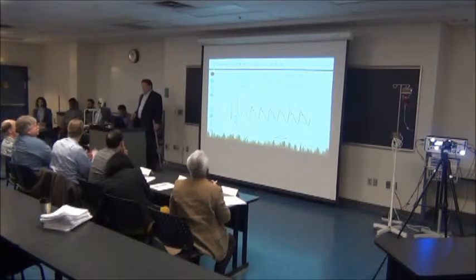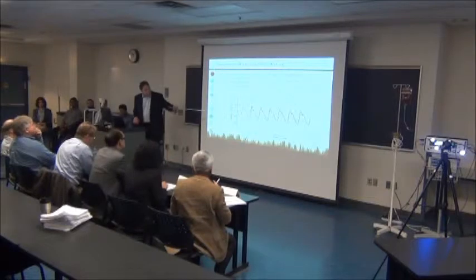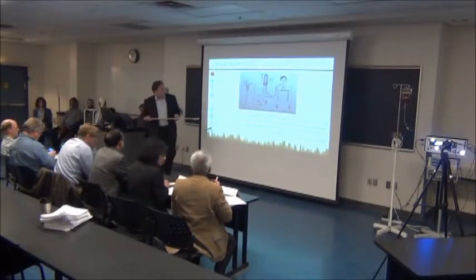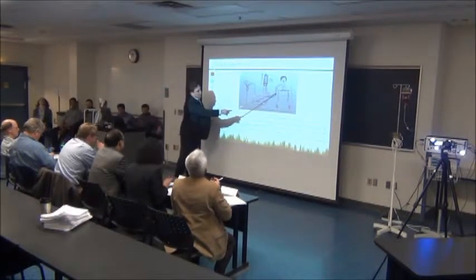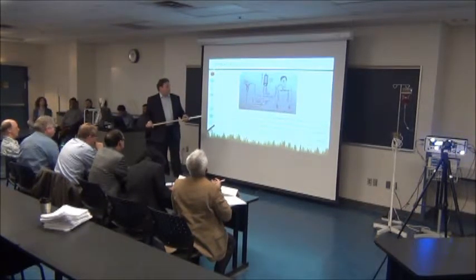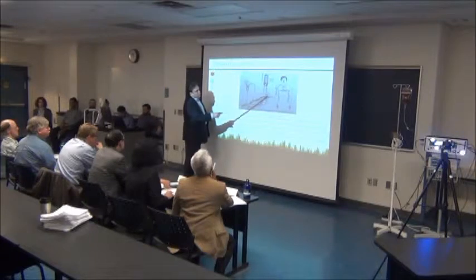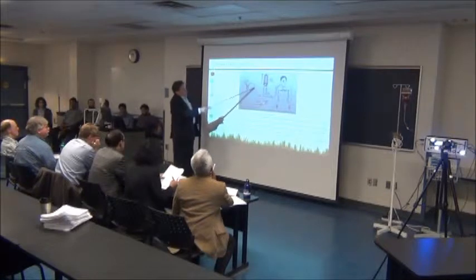Invasive blood pressure monitoring. We are interested in seeing the actual waveform, acquiring it, amplifying it, and displaying it. How do we do this? This is how we do it. A tube, intra-arterial catheter, is inserted into an artery. It's right there. The catheter is connected to the transducer and a saline-filled IV bag with a 3-way connector and tubing. So here's the 3-way connector. So we've got the tubing coming from the artery. There's a saline bag, IV bag, and there's the other tubing that runs right to the transducer.